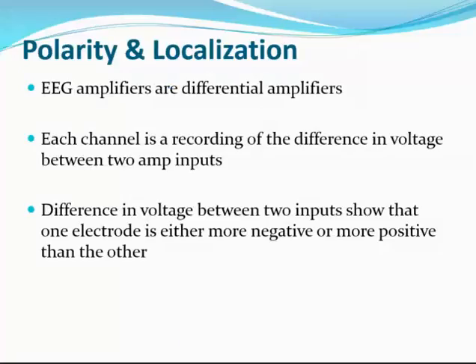Now, in order for us to speak one language, compare this with mathematics, where you have an X and a Y axis. You also may have a Z axis if you're looking at three-dimensional planes. In this case, by the way, this lecture is assuming basic knowledge of the 10-20 system, even the measuring of the head and the whole nine yards of the basics of EEG.